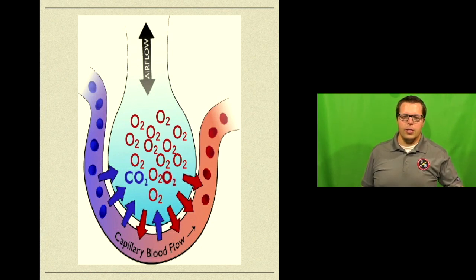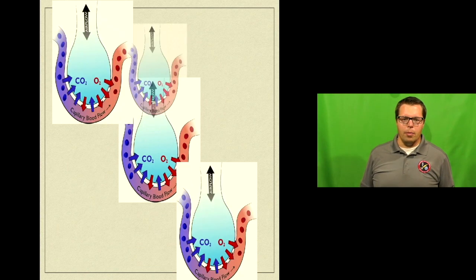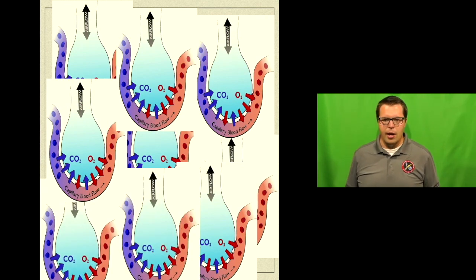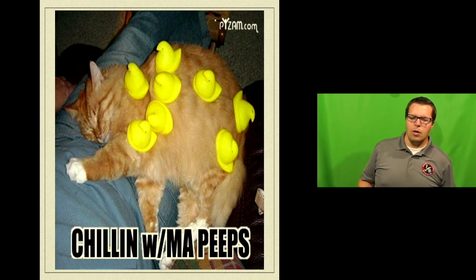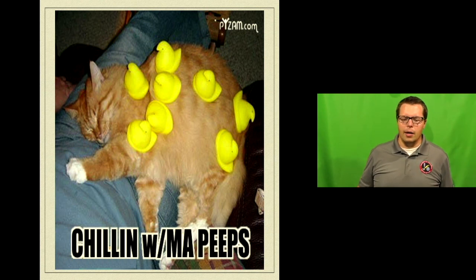Well, instead of increasing the amount of oxygen in each alveolus more, what you probably could do is increase the number of alveoli that are participating in gas exchange. And that is what PEEP does. Positive end expiratory pressure is the thing that opens up more alveoli and lets more red blood cells come in contact with the oxygen. Again, above about 60%, we turn FiO2s up all the time, but if you really want to be elegant and actually fix the problem, usually that involves PEEP most of the time.